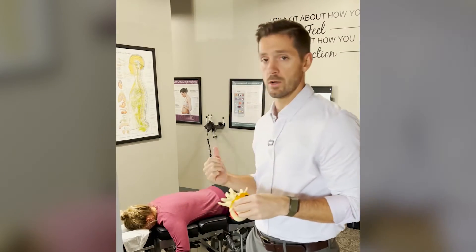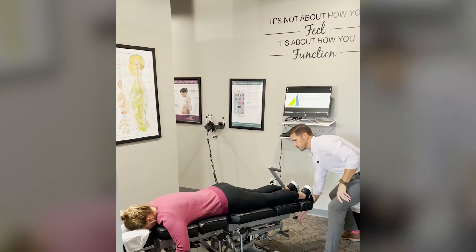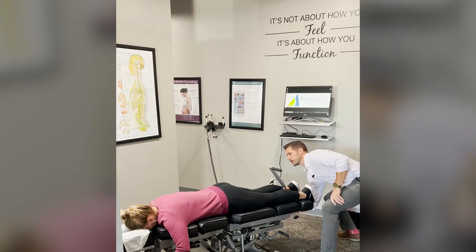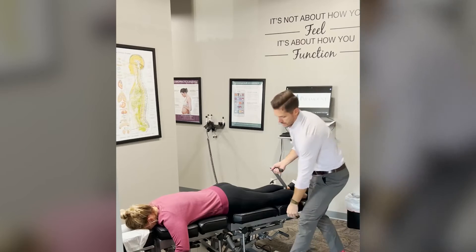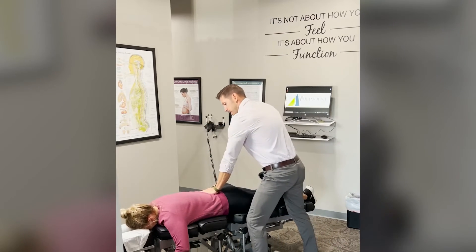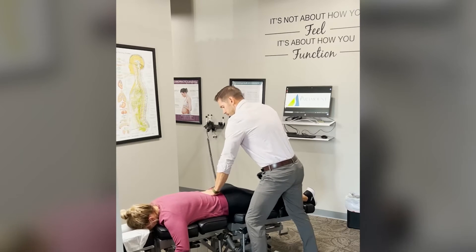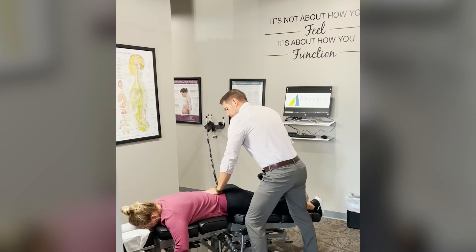I'm going to give you a short demonstration of what that looks like. First we distract the table to create that decompressive force. We then unlock the table and the table comes up and down, helping to create that pumping action in the disc. We can also go side to side if there is a herniation on one side or another.